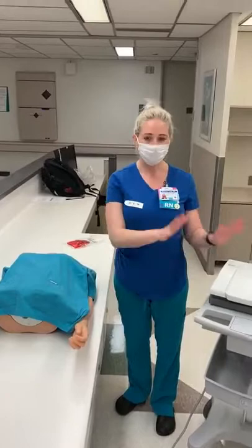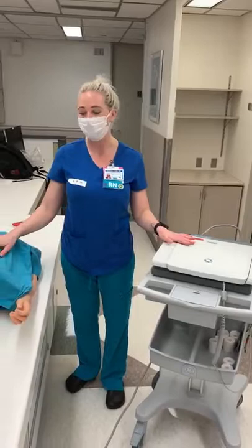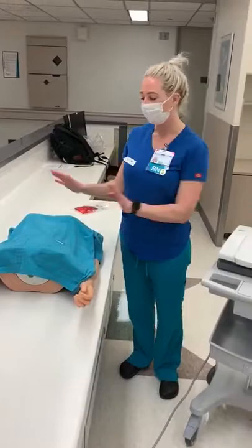Hey guys, it's Shannon and I'm one of the unit-based educators here at Baylor St. Luke's. I'm just going to talk you guys through today how to use the 12-lead EKG machine and how to perform a 12-lead EKG on your patient. We'll start first by putting the leads on the patient and then we'll move over to the machine and get that all ready to go.